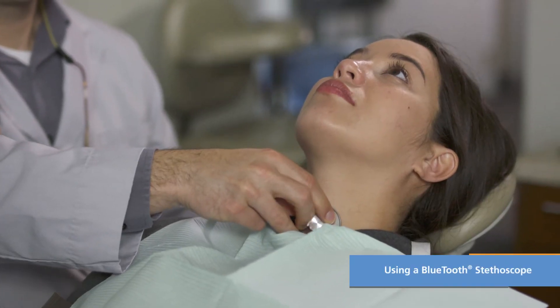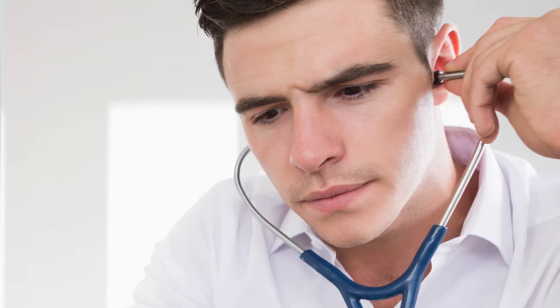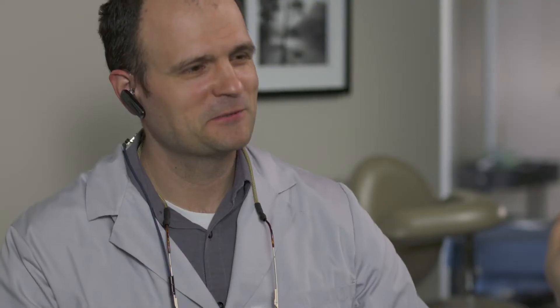You may already be using either a traditional style or Bluetooth stethoscope in your practice for monitoring respiration and are wondering why you still need capnography. With a traditional stethoscope, it can be difficult to hear adequately because dental procedure areas can be noisy. An amplified Bluetooth stethoscope is preferred because it has a microphone built into a housing that minimizes procedural noise, amplifies breathing sounds, and is equipped with adjustable volume controls.